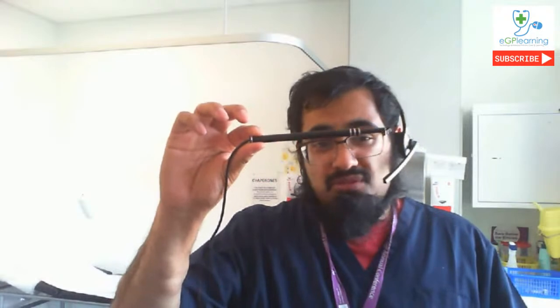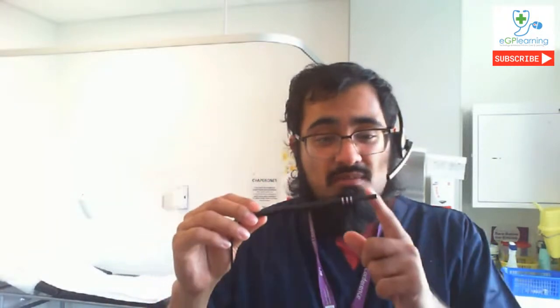And I was lucky enough to have one of my digital endoscopes. So I've got this little thing here. So it's a pretty simple piece of kit. It's just got a camera at this end, cable goes into my computer and connects up to the screen. I can use it with my camera app and stuff.